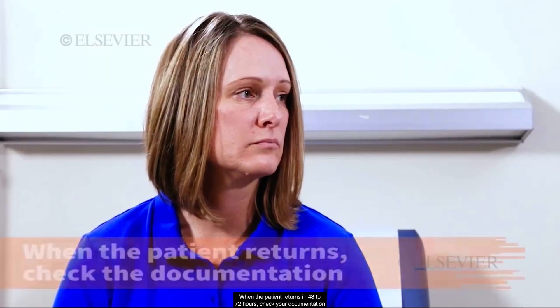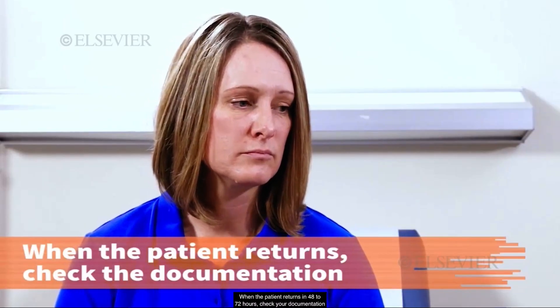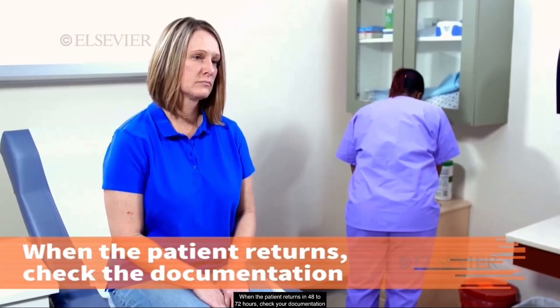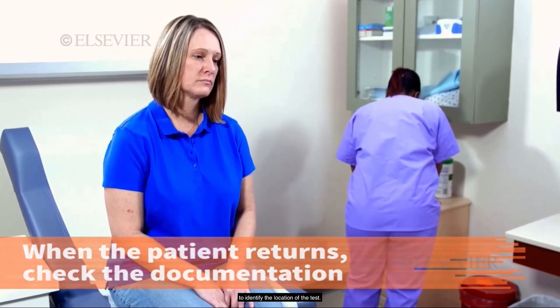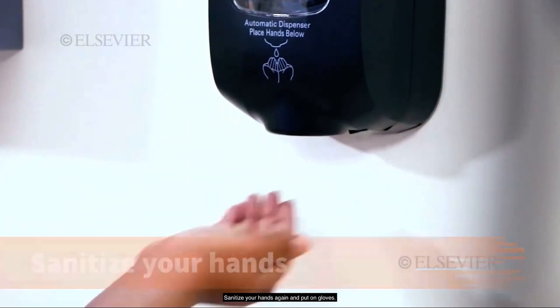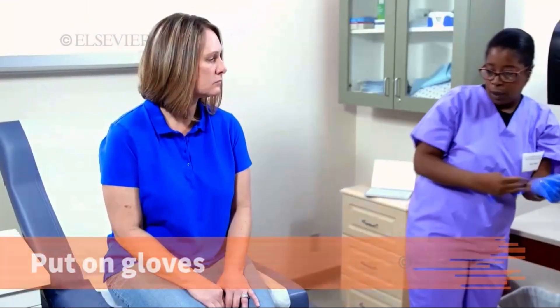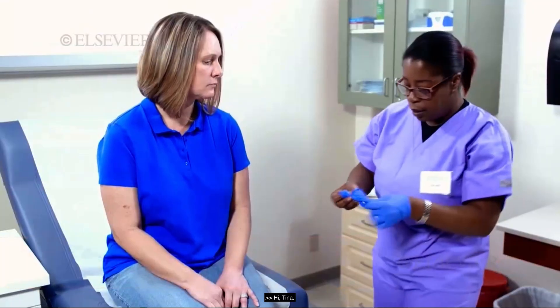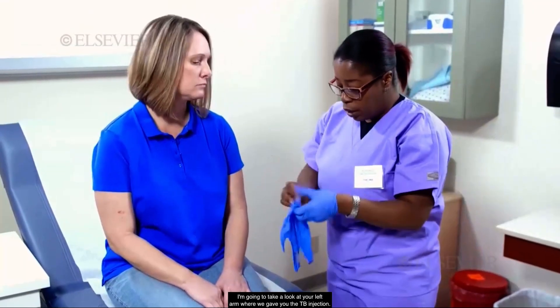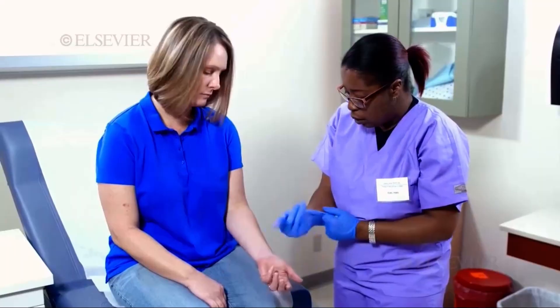When the patient returns in 48 to 72 hours, check your documentation to identify the location of the test. Sanitize your hands again and put on gloves. I'm going to take a look at your left arm where we gave you the TB injection.